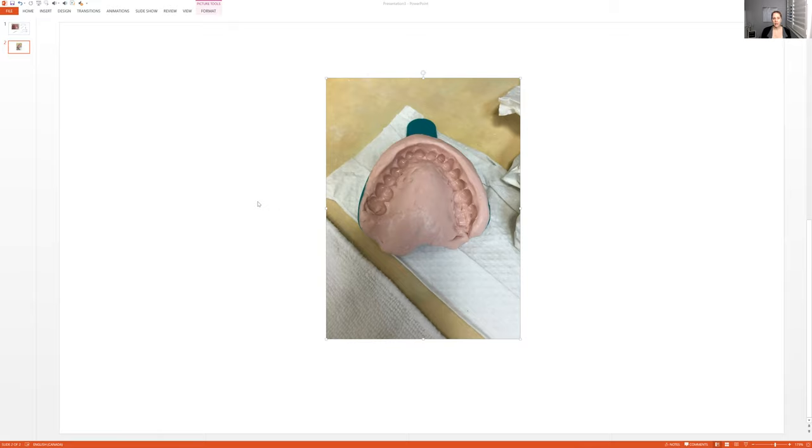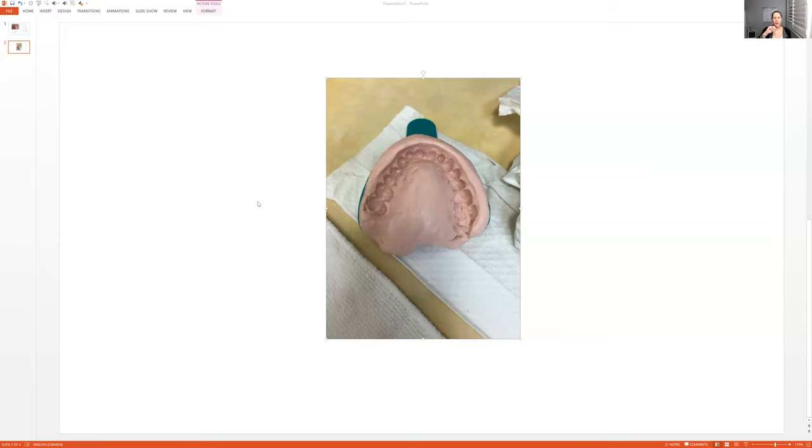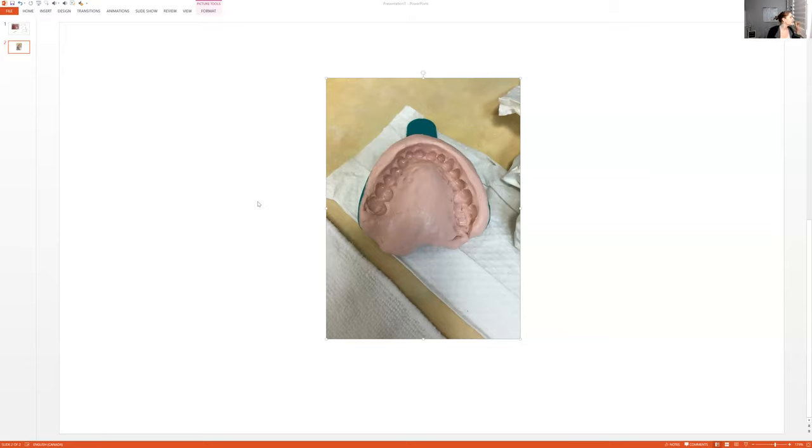I mix up the impression material. I put it in the tray. It kind of feels kind of slimy, but that's it. It doesn't taste like anything. I will hold it there for about 60 seconds. That's it. I take it out and then that's it. And then I do the same thing for the bottom. Make it sound easy. Don't make it sound complicated.